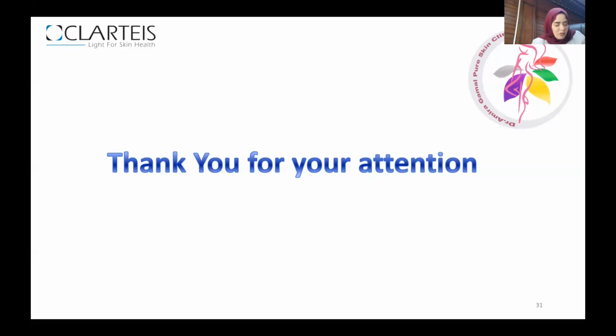By the way, sorry, Ibrahim. By the way, the post-inflammatory hyperpigmentation, which happens with the excimer light, it's very, very simple. Not like the other laser. Actually, if it happened with you, it will disappear in a few days. Don't worry.